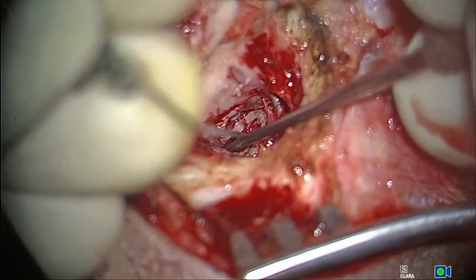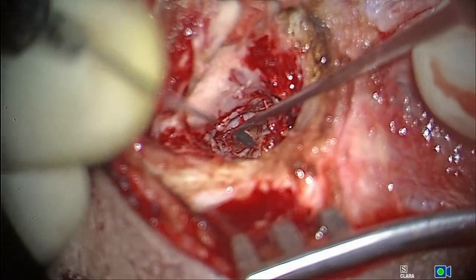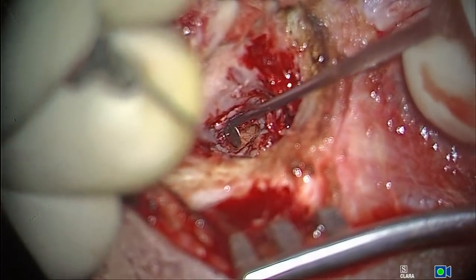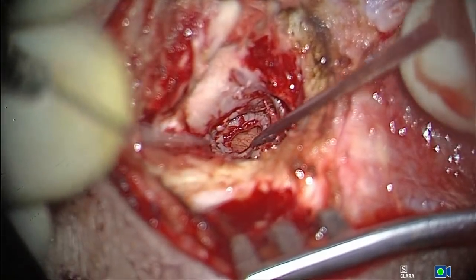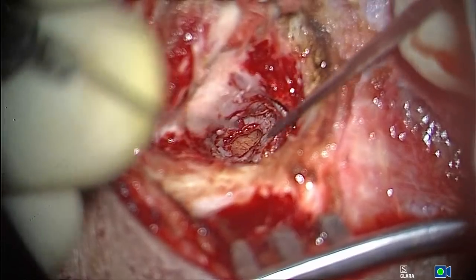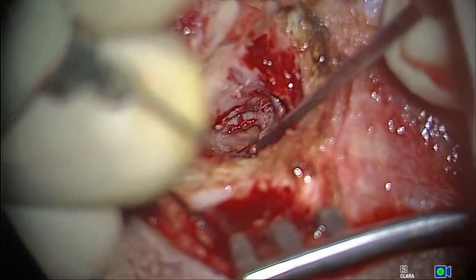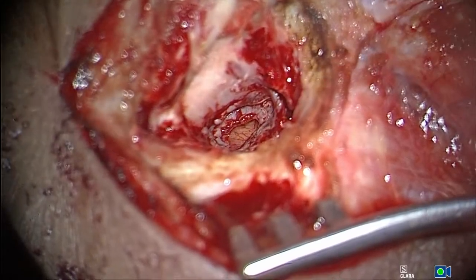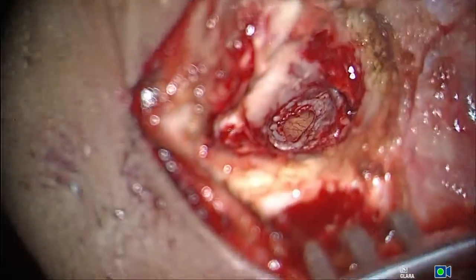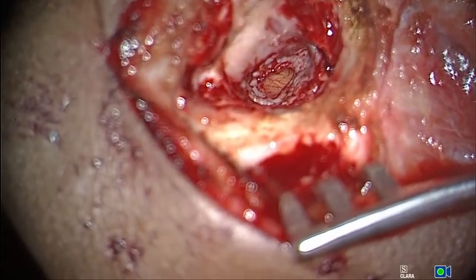See that the flap has not been torn. This is always in residents, when they do it, I don't want the flap torn at all. This is something which shows the dexterity of the surgeon. Okay, now I have replaced it very, very nicely. Can you all appreciate that now?